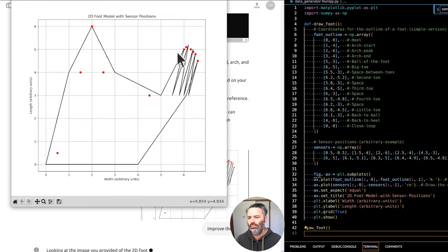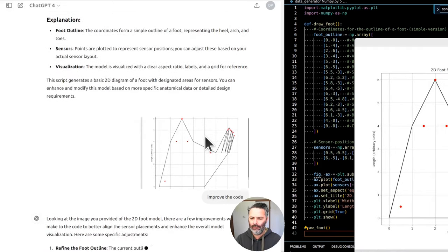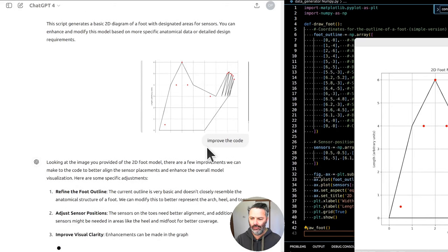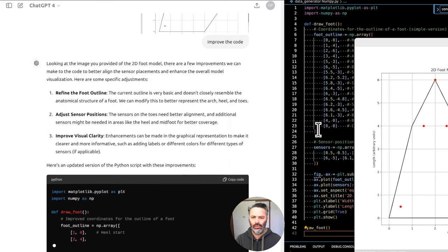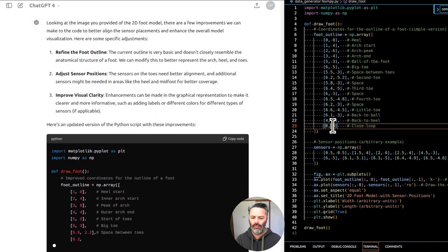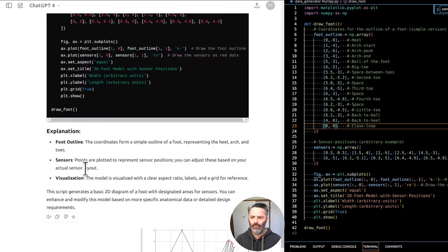5. Validation through community feedback or user testing. Even without expert consultation, getting feedback from users or a community familiar with foot mechanics can be invaluable. User testing: if possible, have individuals use the adjusted model during walking or running and provide feedback on comfort and perceived accuracy. Community input: share your findings and adjustments in online forums or communities dedicated to biomechanics, sports science.